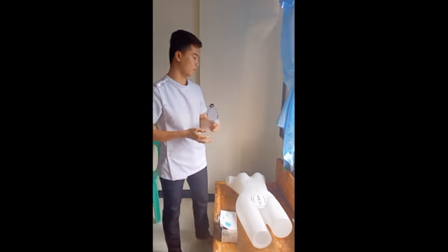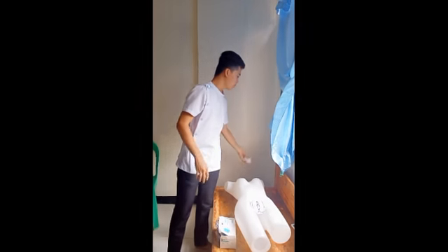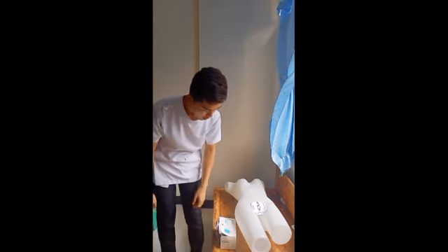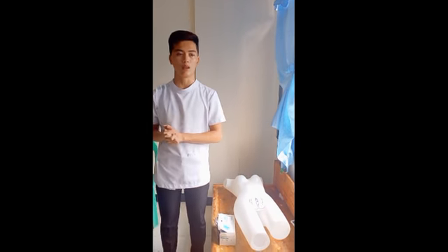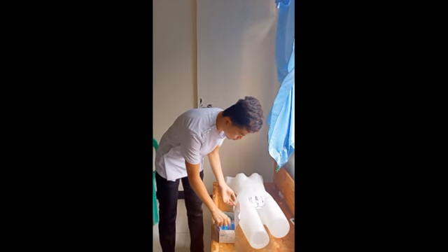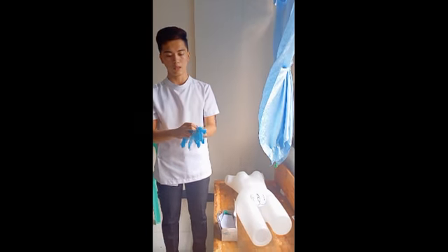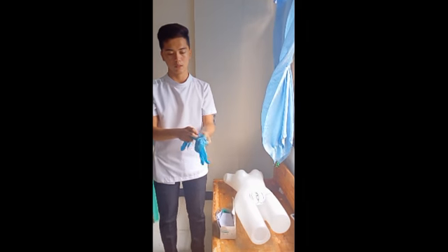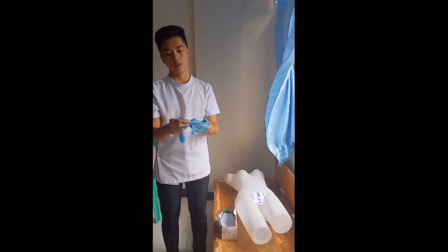This plastic I'm going to put in this trash can. So the next I'm going to wear gloves, which are the sterile gloves. Let's assume this is the sterile gloves, since I don't have it. You need to apply all the sterile techniques throughout the entire procedure.